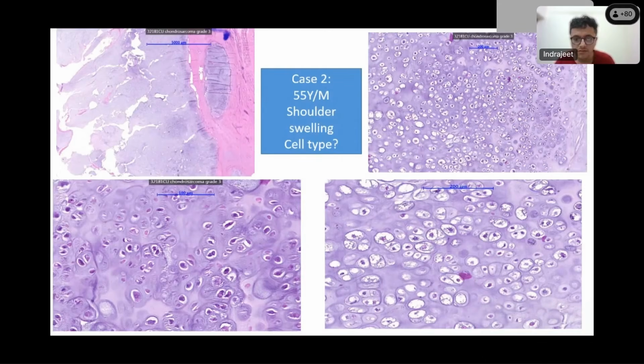Lots of chondrogenic matrix, as well as many cells with binucleate morphology. A lot of atypical chondrocytes are seen as well. There are lacunae. Why do you recognize it's cartilage? Because there is this typical blue cartilaginous matrix. So the chondroid matrix, and that is what I was referring to in the earlier case. Then there are these lacunae wherein you can find these chondrocytes. Some lacunae have two cells, some have one, but then this nuclear atypia is glaring.